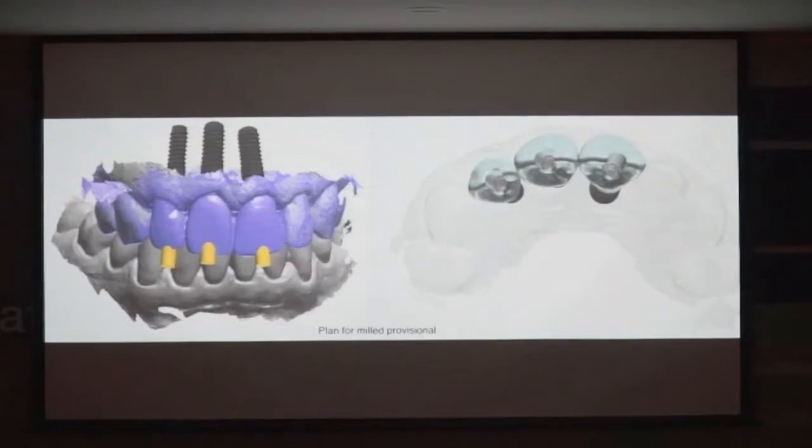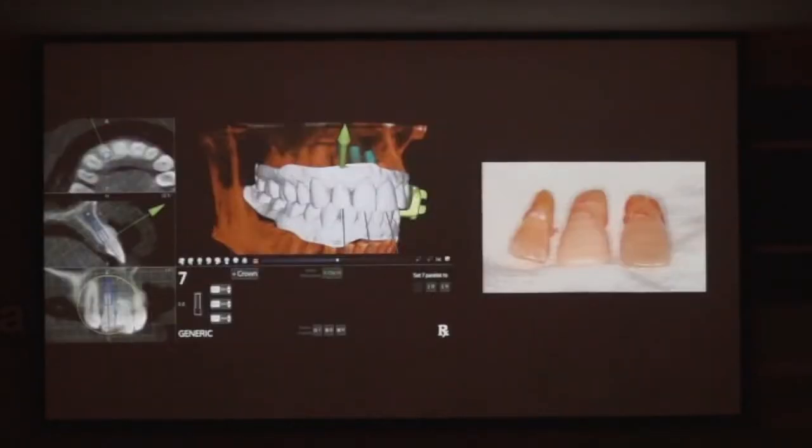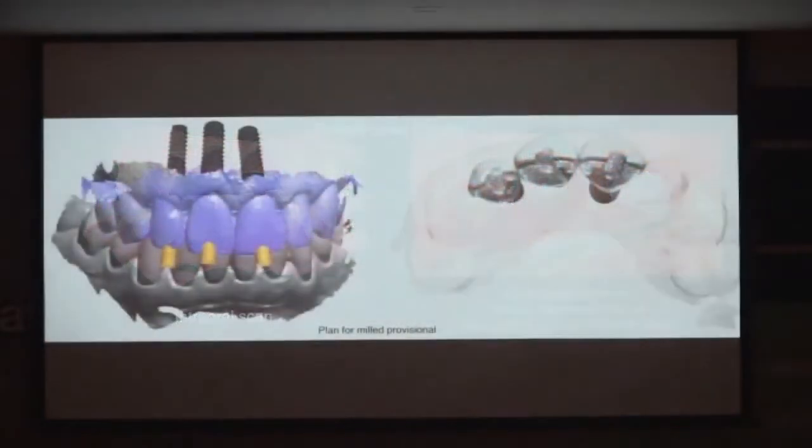And if I go back to my plan, you're going to see that I was limited by the buccal bone. But as long as I know they're restorable, and I talked to the restorative doc ahead of time, everybody's on the same page, we're going to get a nice result. And I'll show you.